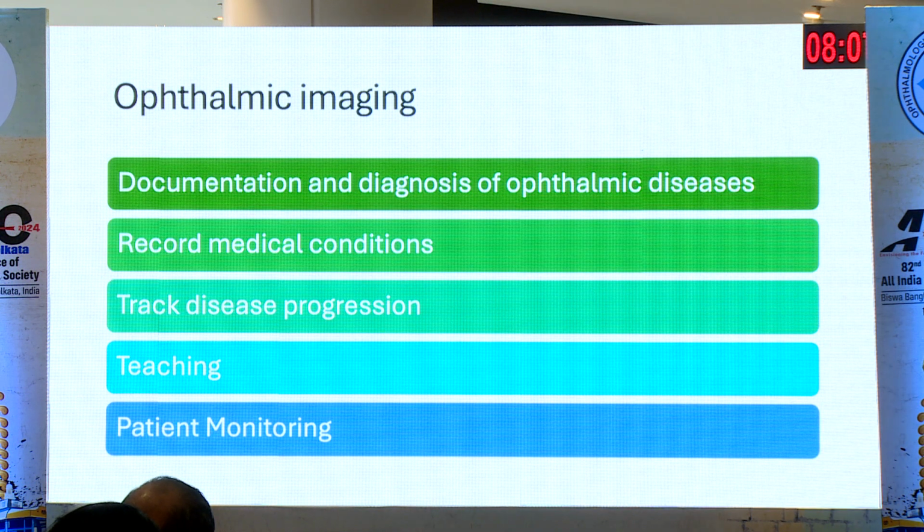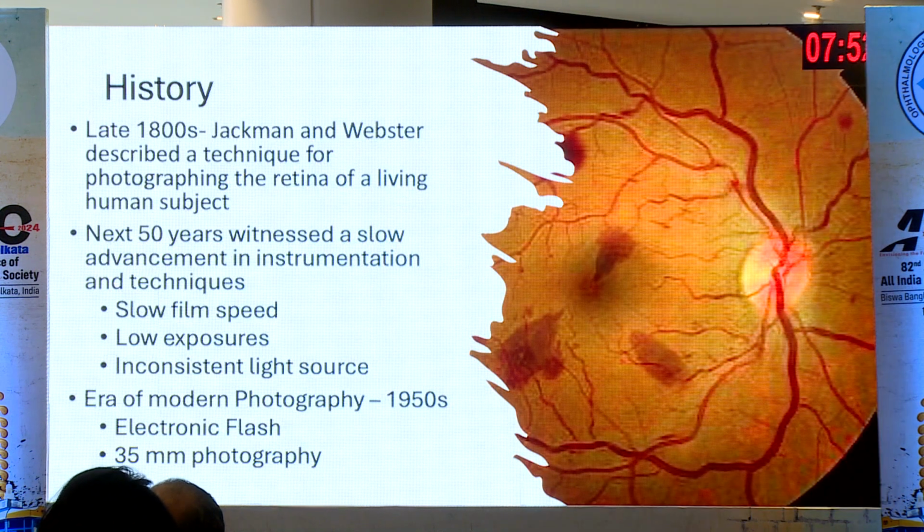Ophthalmic imaging has played an important role in documentation and diagnosis of ophthalmic diseases and to record medical conditions. It has been used to track disease progression, teaching and patient monitoring as well.